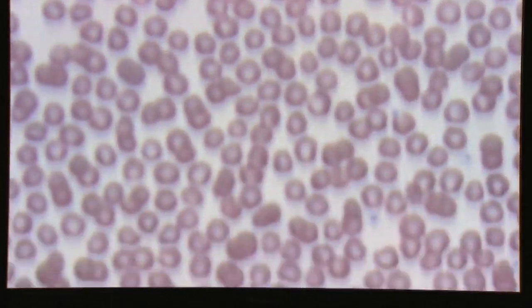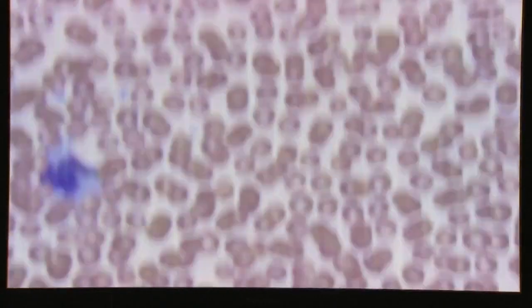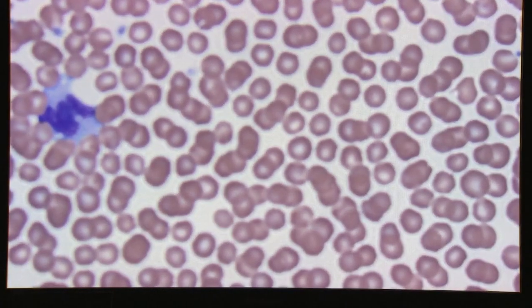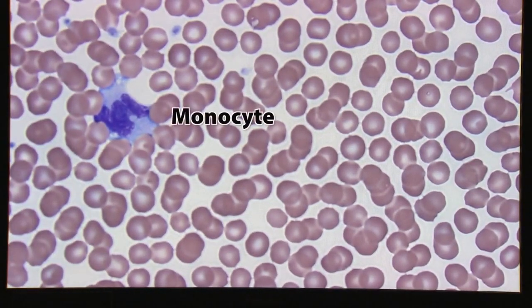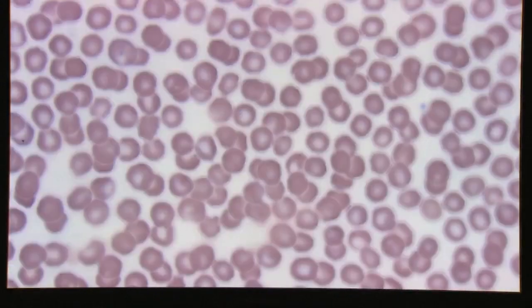If you encounter nucleated red blood cells, they are counted on top of your white blood cells. So you always count 100 white blood cells, and then your nucleated reds are on the side. So that number comes out as X nucleated reds per 100 white cells. The next step would be to do your red cell morphology.